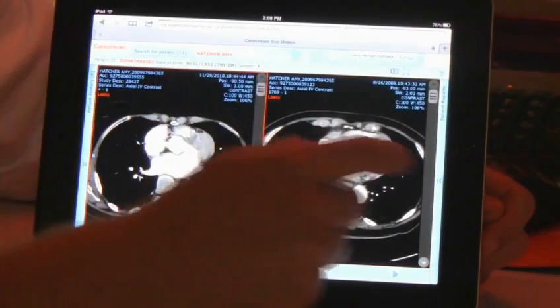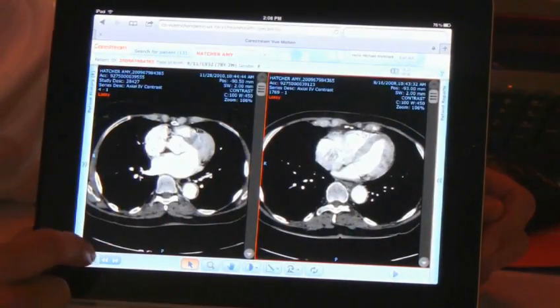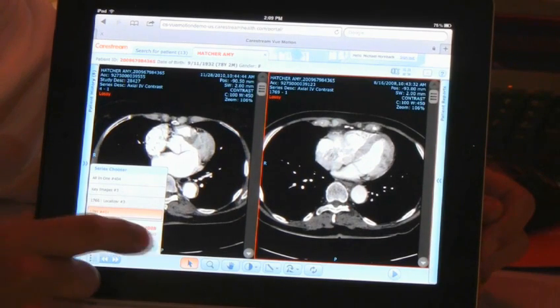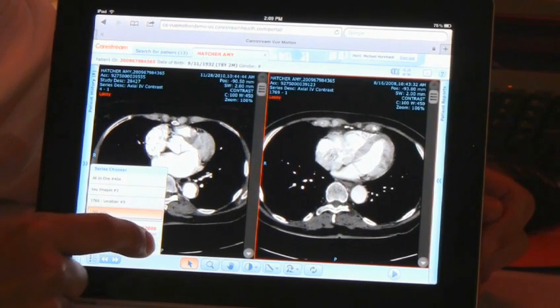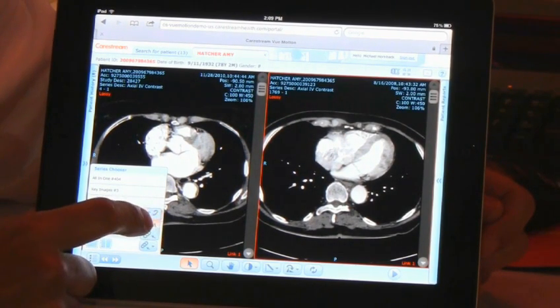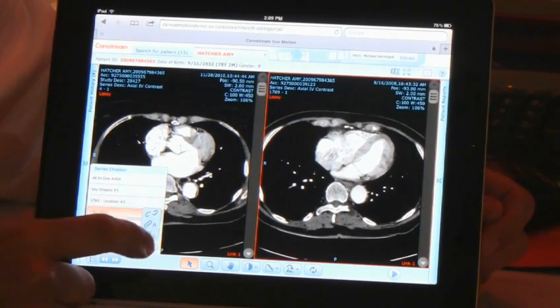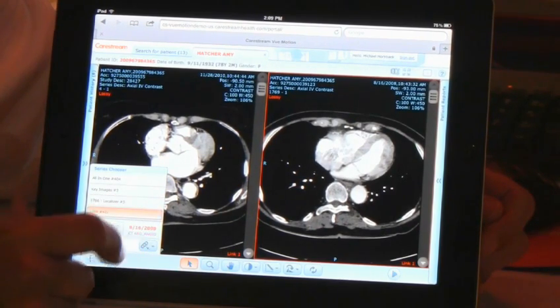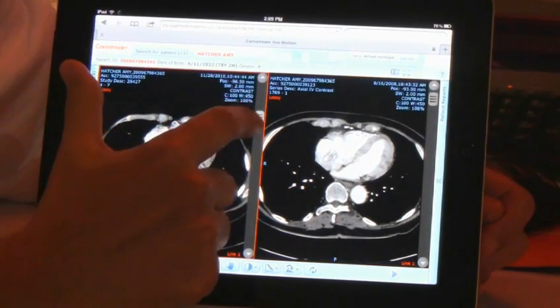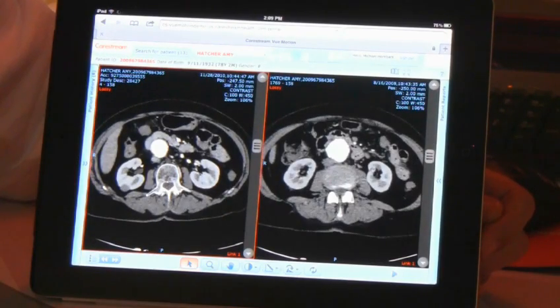When you're displaying two volumetric sets, we now have the ability to automatically link those studies together if there's sufficient DICOM information, or you can manually link the studies and scroll through them simultaneously, just as you would on a full client.